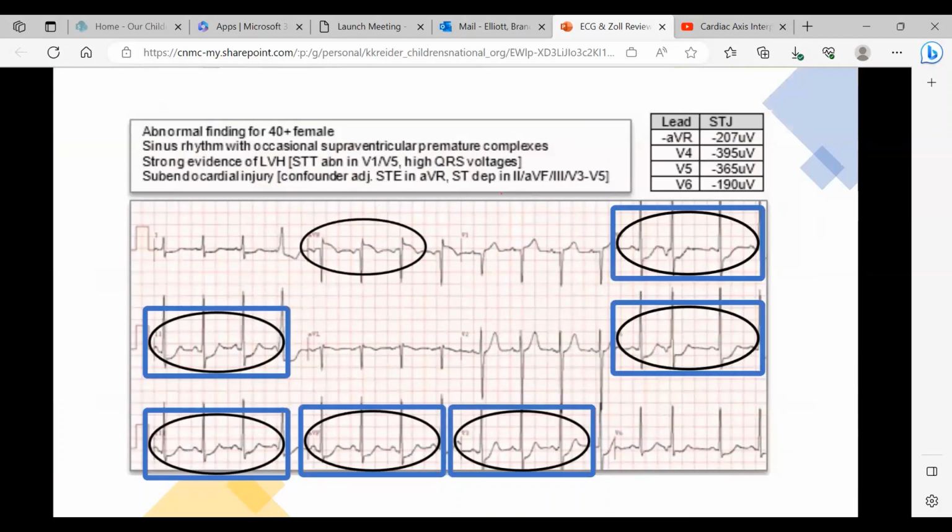So tell me, what's the medical history, right? This really depends on what the story is, as we could call this an AVR STEMI because we have the elevation in AVR, it's greater than V1, and then we have depression elsewhere. But that elevation can be caused by so many different things that it's really story dependent. So this is an example of an ugly looking 12 lead that is going to be based on signs and symptoms presentation, as well as what's going on currently, and that AVR is abnormally elevated.